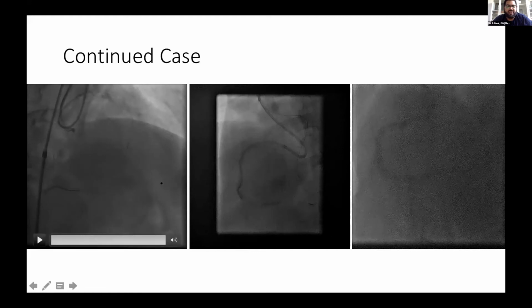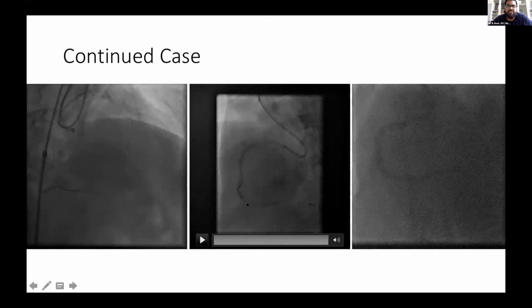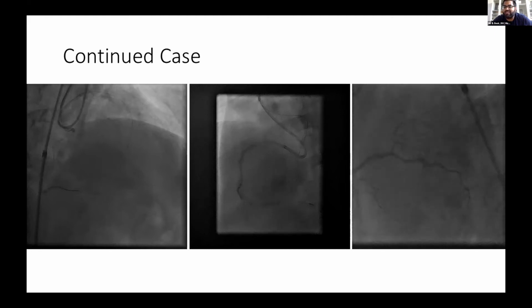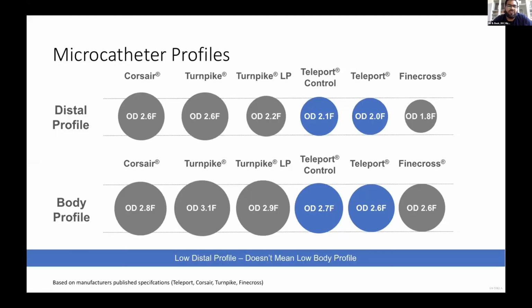And so you see in this 60 millimeter occlusion, heavily calcified, I picked the wrong microcatheter, right? I needed torqueability here. The lower profile of a Caravel was helpful to get through the septals, and I quickly got to the distal cap, but getting through the CTO was really a pain. And so all of the examples from Dr. Wu's previous lecture are just running through my mind here. Honestly, I should have just quickly switched out for a torqueable microcatheter, and it would have made my life a lot simpler. But I spent 30 minutes getting more and more support till finally that Caravel did ultimately get through, stented back after externalizing with an R350, and got a good overall result.